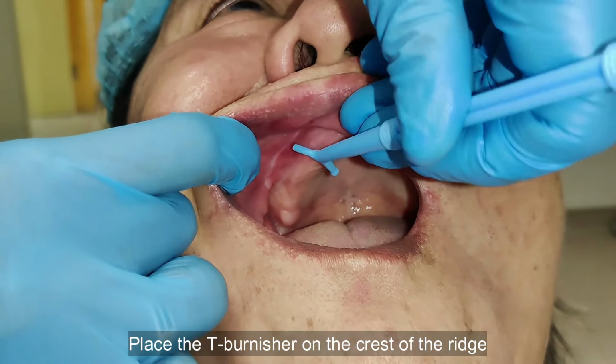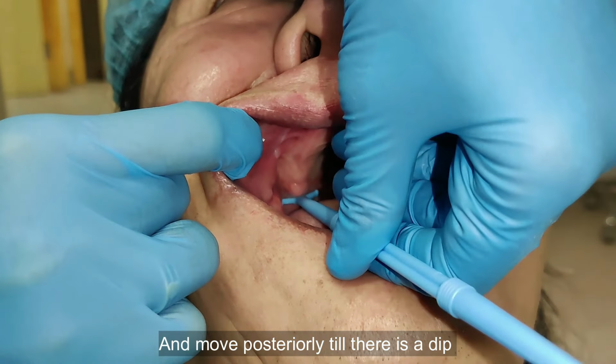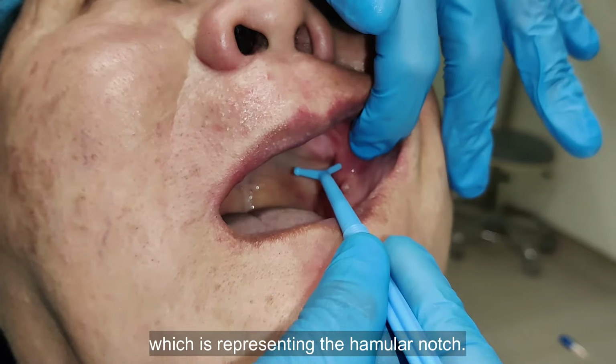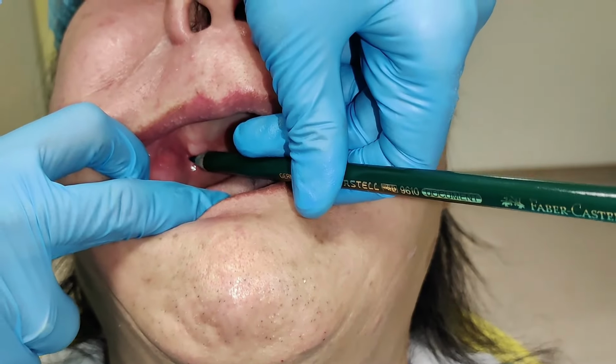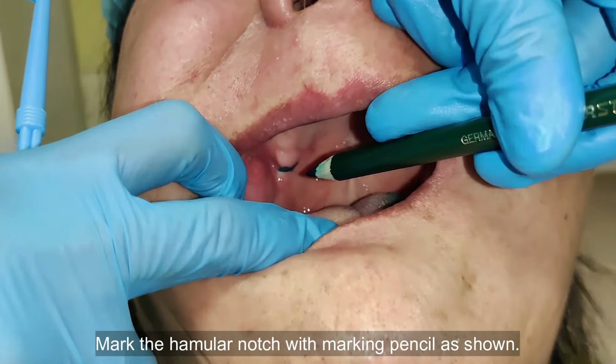Place the T-burnisher on the crest of the ridge so that the ball end is towards the palate and move posteriorly till there is a dip which is representing the hamular notch. Perform the same on the other side and locate the hamular notch. Mark the hamular notch with a marking pencil as shown.